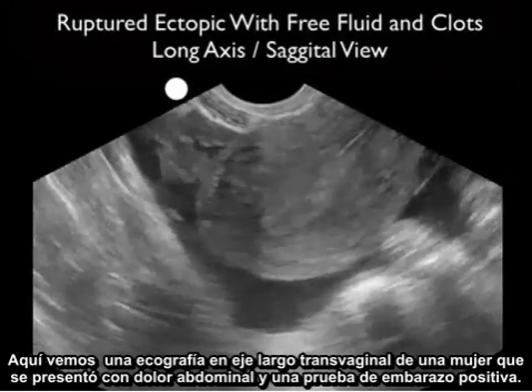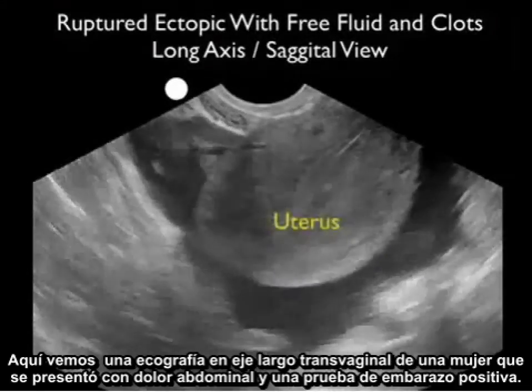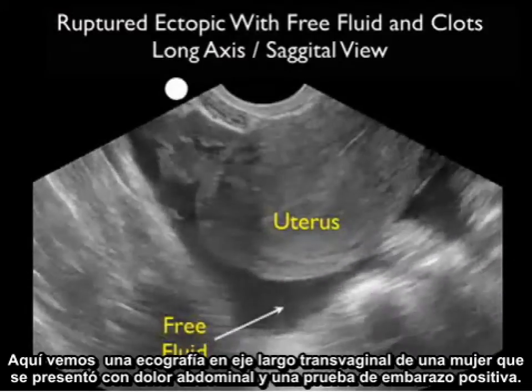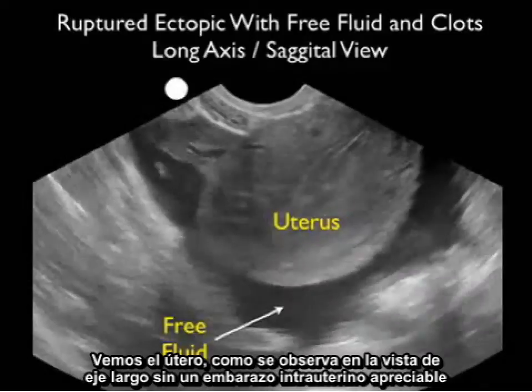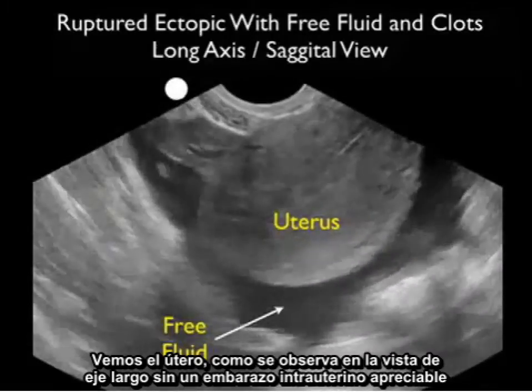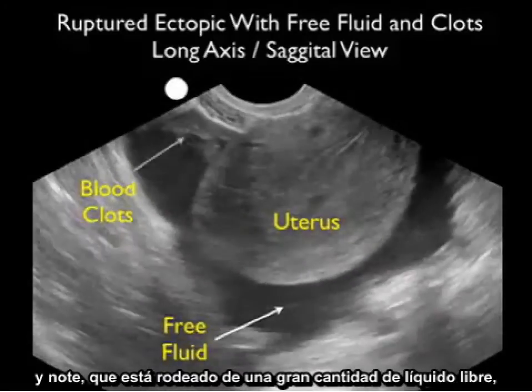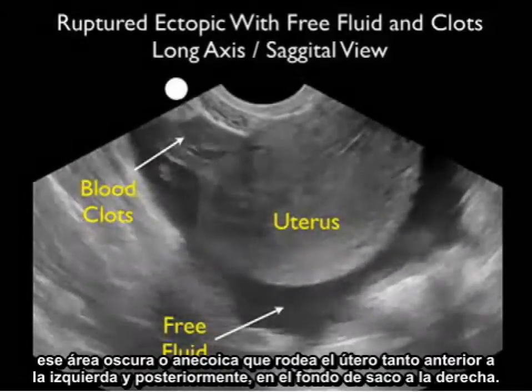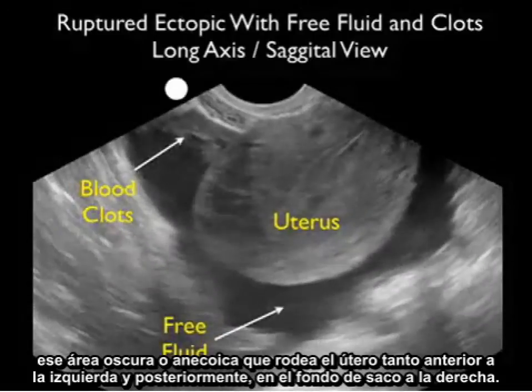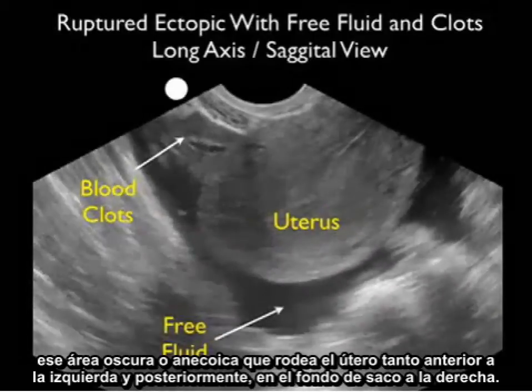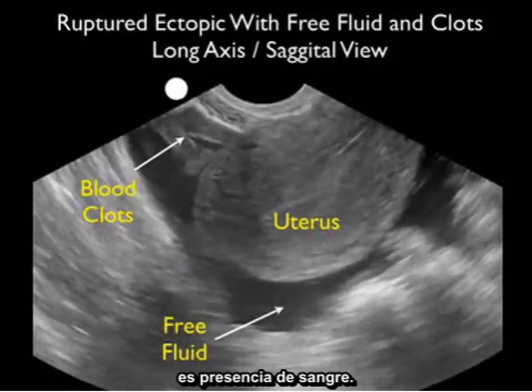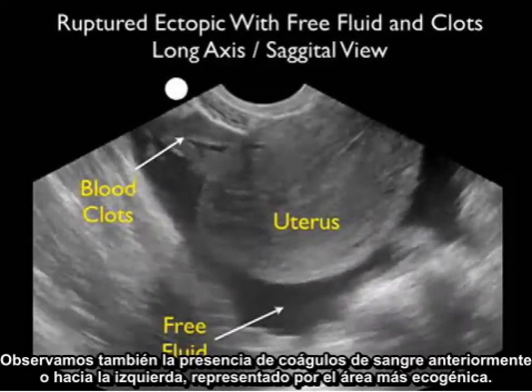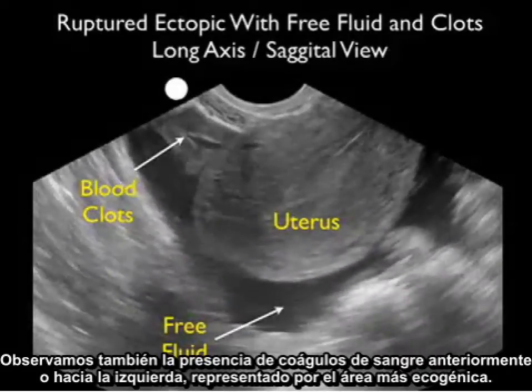Here's a transvaginal long axis ultrasound from a woman who presented with lower abdominal pain and a positive pregnancy test. Notice the uterus, as shown in the long axis view, without an appreciable intrauterine pregnancy. Notice that it's surrounded by a large amount of free fluid — that dark or anechoic area — surrounding the uterus both anteriorly to the left and posteriorly in the cul-de-sac to the right. That is the presence of fresh blood. Notice also the presence of blood clots anteriorly or to the left, that more echogenic area.